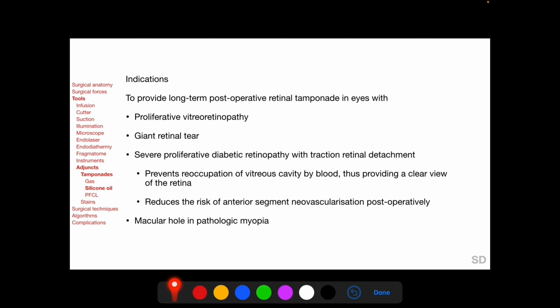But if an eye is planned to be left phakic following silicone oil injection, it too should undergo preoperative biometry, because if cataract develops in an eye with silicone oil, axial length is overestimated by ultrasound A-scan through silicone oil, resulting in an underestimation of IOL calculation and hyperopic postoperative refraction if adjustments are not made in the recorded axial length. But axial length measured by optical biometry is almost the same with or without silicone oil, and eyes undergoing silicone oil injection should preferably not be left aphakic, which significantly increases the risk of keratopathy and pupil block.